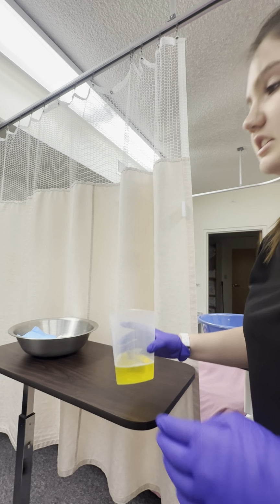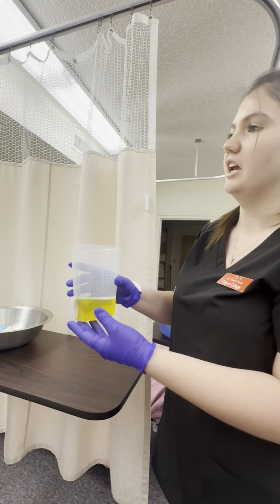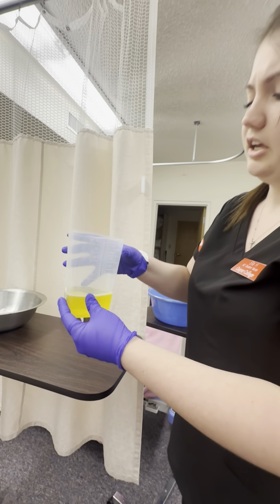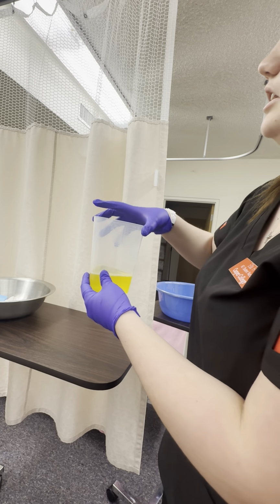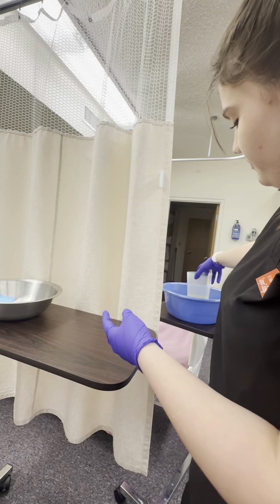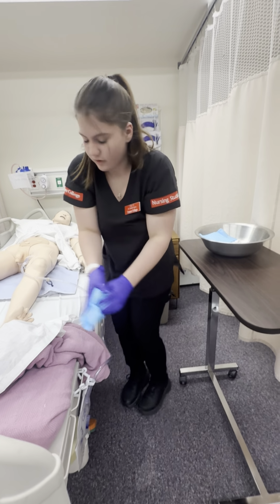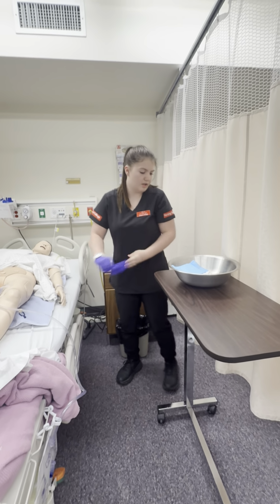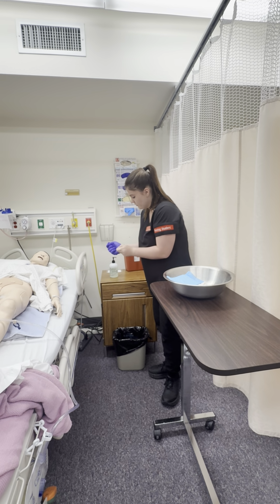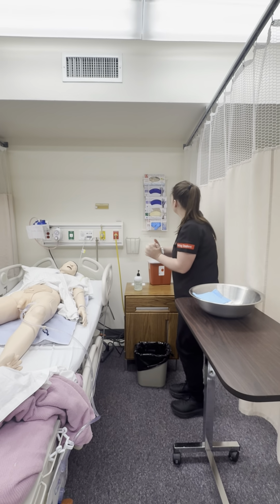So now that I've taken this, I'm gonna go ahead and properly dispose this as per facility policy. So this would be in a toilet or in a sink. I'm just gonna go ahead and set this, but without leaving the patient's room, and I'm gonna set it in the commode that is in the patient's room. Okay, and I'm gonna go ahead and dispose of these chucks here on the floor as well. Okay. Now I'm gonna just change my gloves really quick before I handle this patient's catheter.